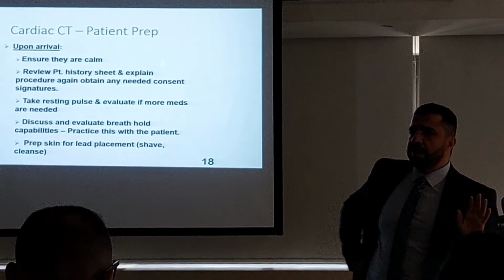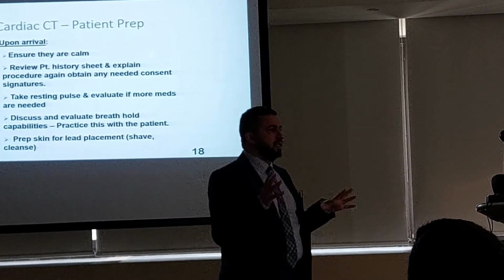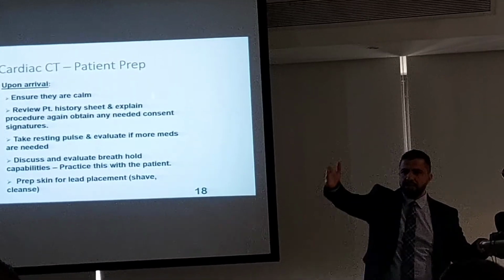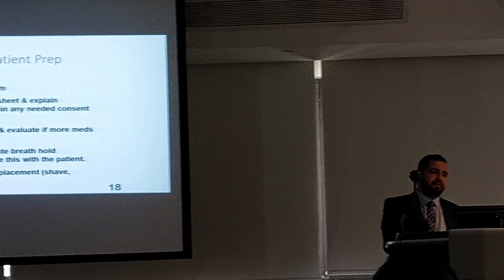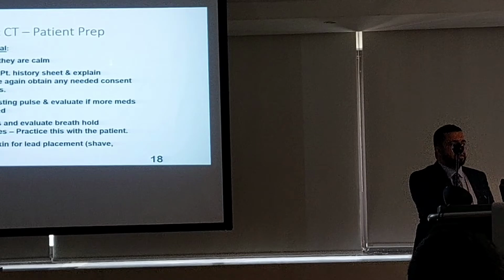Okay, I will come, I will give him the beta blocker. I know it's yours, it's your policy. But I should start with this, instead of keeping him waiting for some time and then checking the heart rate, and again keeping him waiting for the heart rate to be reduced. Discuss and evaluate breath-hold.